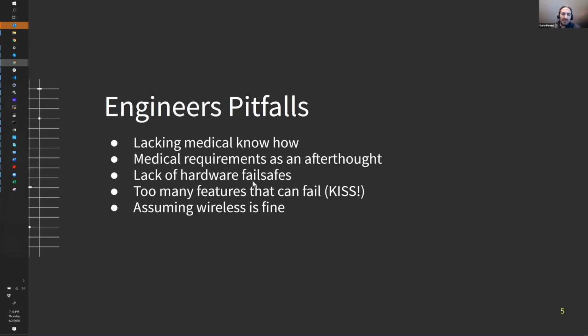And again, we are engineers. I am one of those who like to add as many features as possible, and we always end up overcomplicating everything. So let's keep it simple. Simple, stupid, right? Let's keep it manufacturable, with the least possible amount of parts, the easiest to source. I mean, think about the fact that there are places where very likely motor controllers, but even ambu bags are not easily available. And this kind of shortage will increase with the demand and with the fact that even logistics is a nightmare today. Couriers are not delivering anymore.